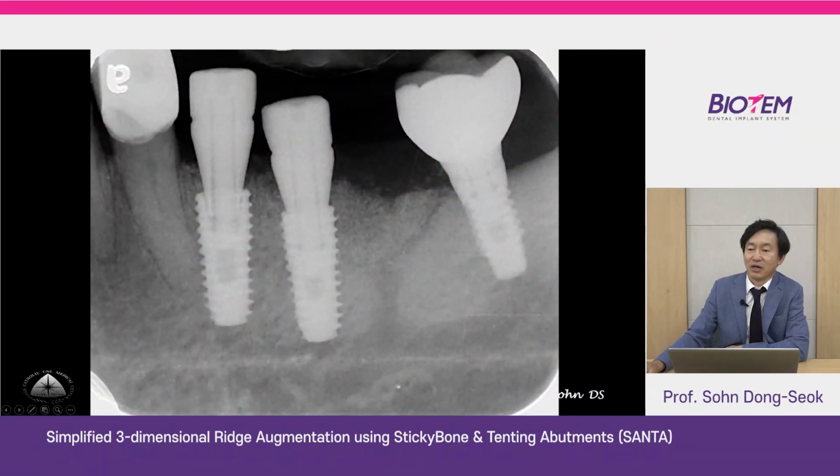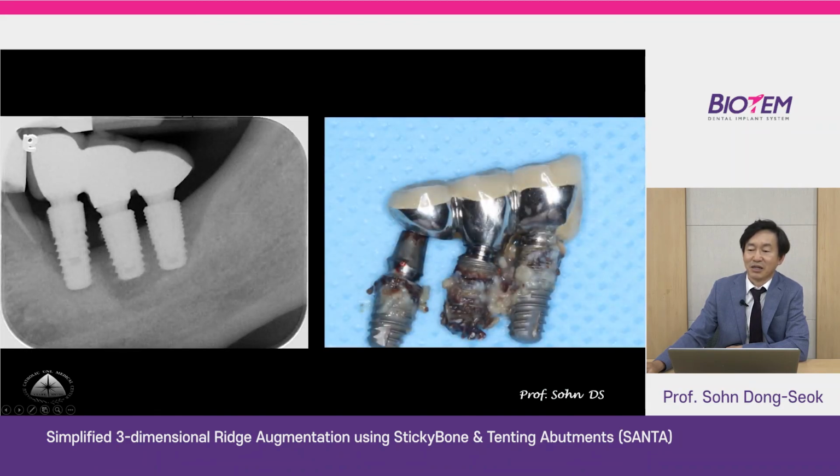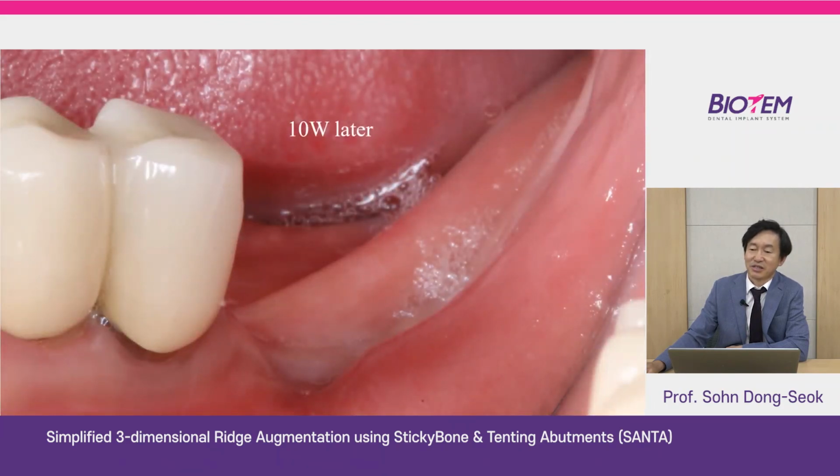This is post-op. This is okay. After 4 months healing, the wound was exposed. This is before. This is after 6 months loading. You can see the beautiful vertical ridge augmentation with this simple technique. This is a similar case.